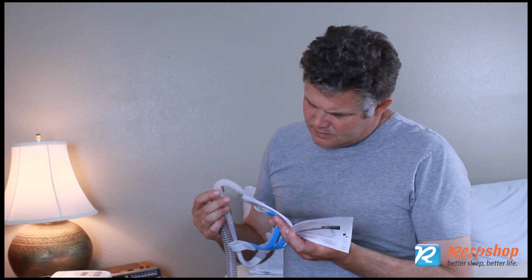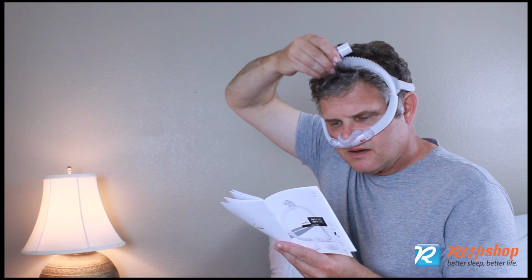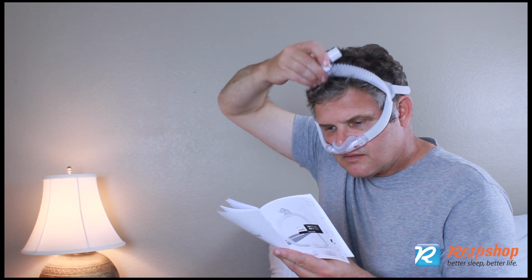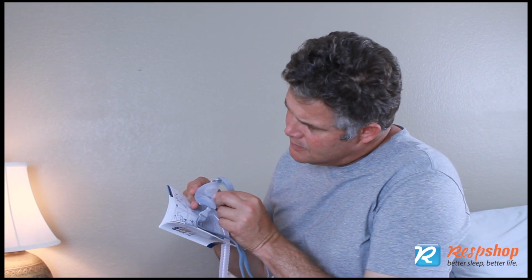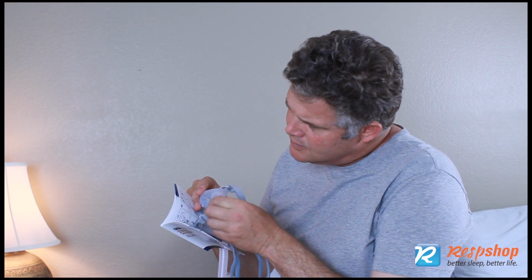Look for insider hints in the directions. The AirFit N30i guide suggests tilting the frame forward and backwards depending on the leak location. The Brevida nasal pillow directions suggest that you make sure the pillow tip has not gotten inverted.